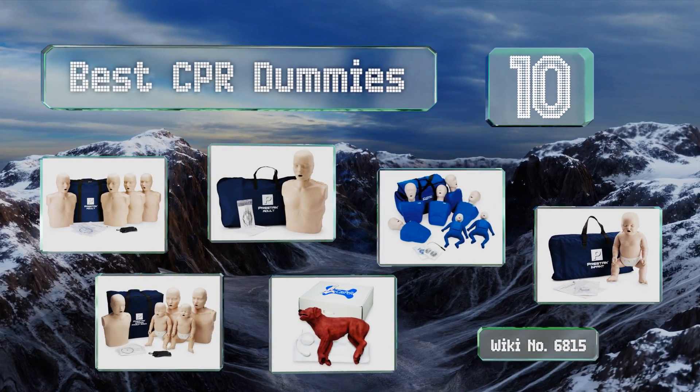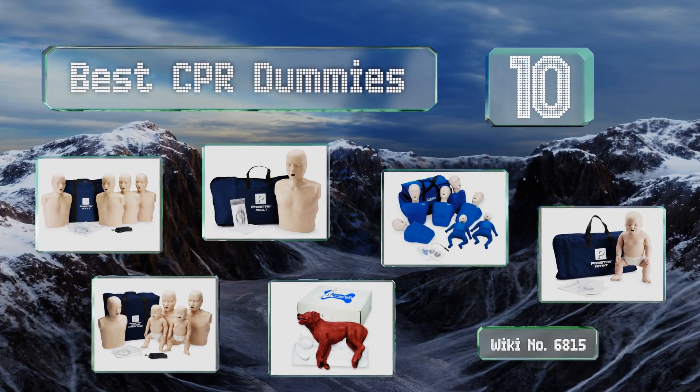Easyvid presents the 10 best CPR dummies. Let's get started with the list.